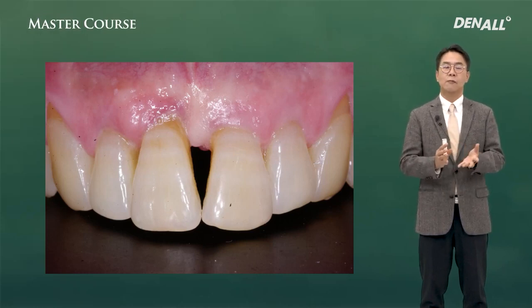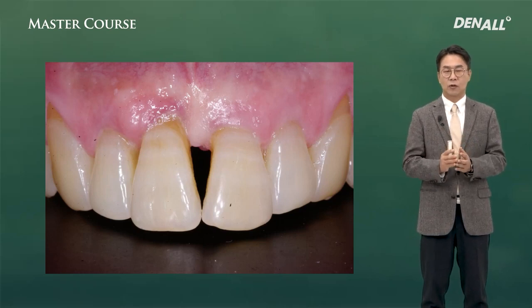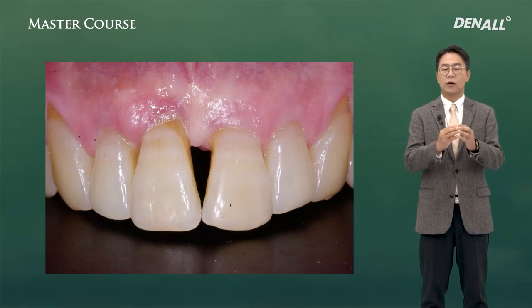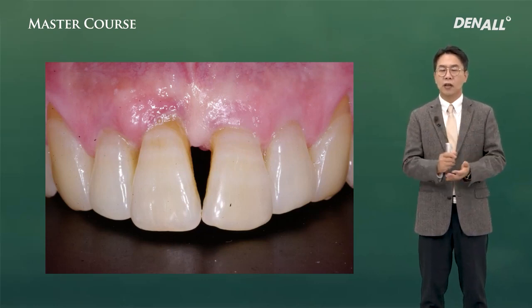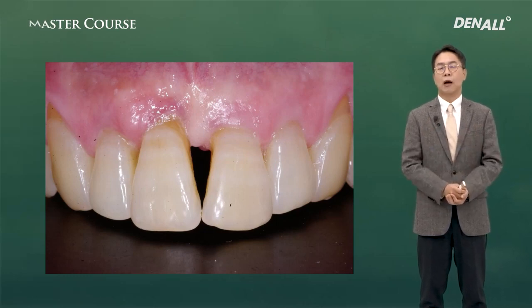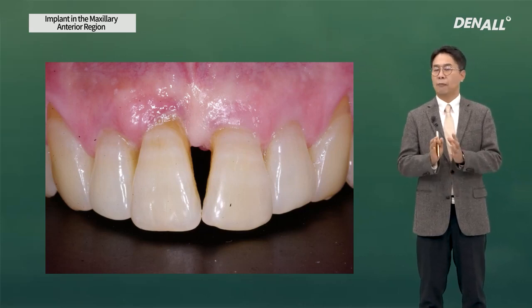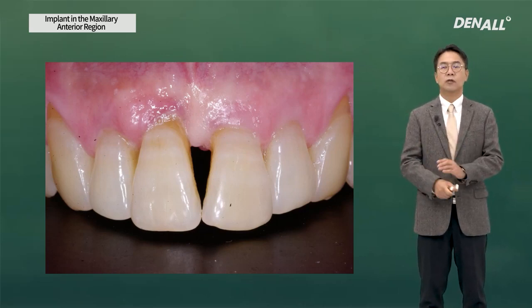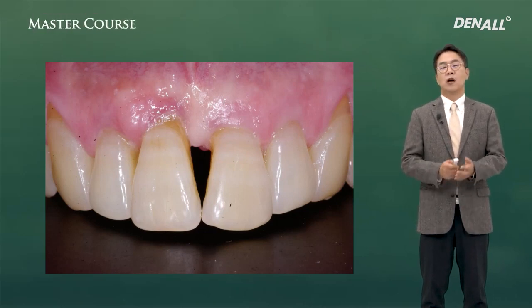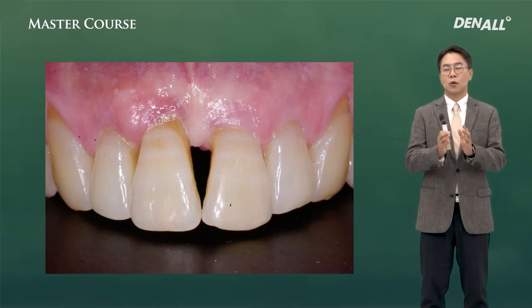To cover it prosthetically, the contact point between 11 and 21 is quite low at the incisal part, and the contact point can be brought down a little bit, then the teeth would look squared. So this should be considered and reflected in the treatment plan so that they can be implemented during surgery, which is very important. So when we look at the form of teeth, we can check this.